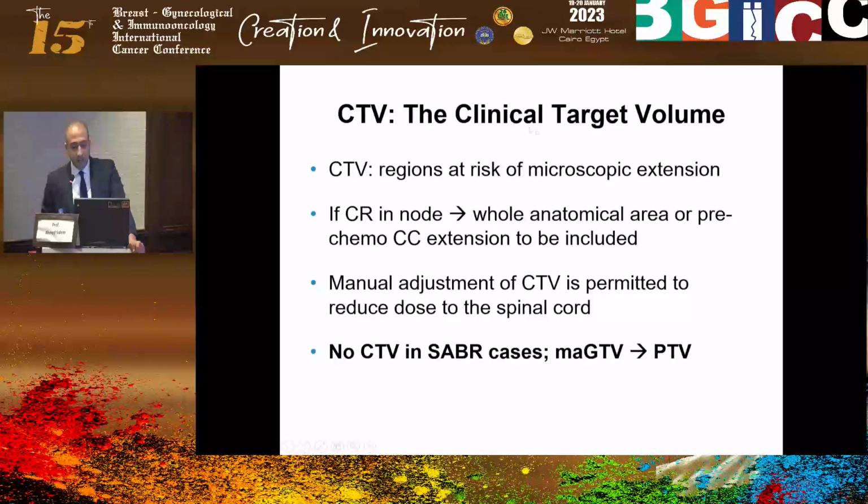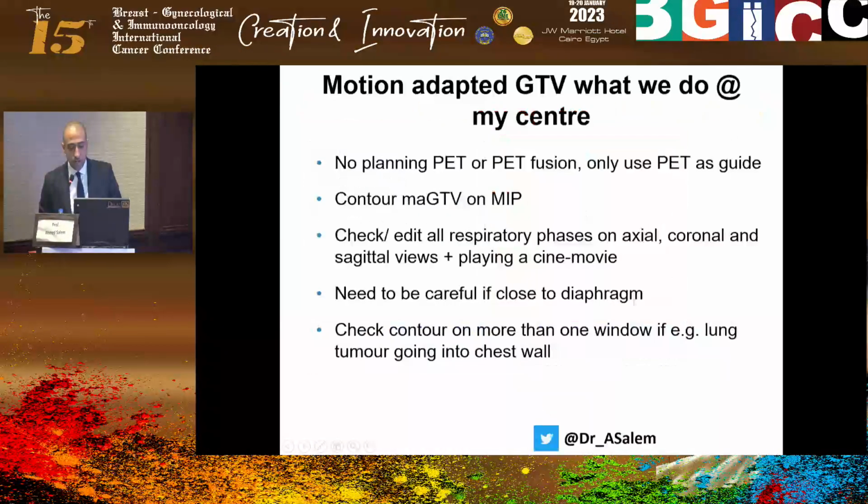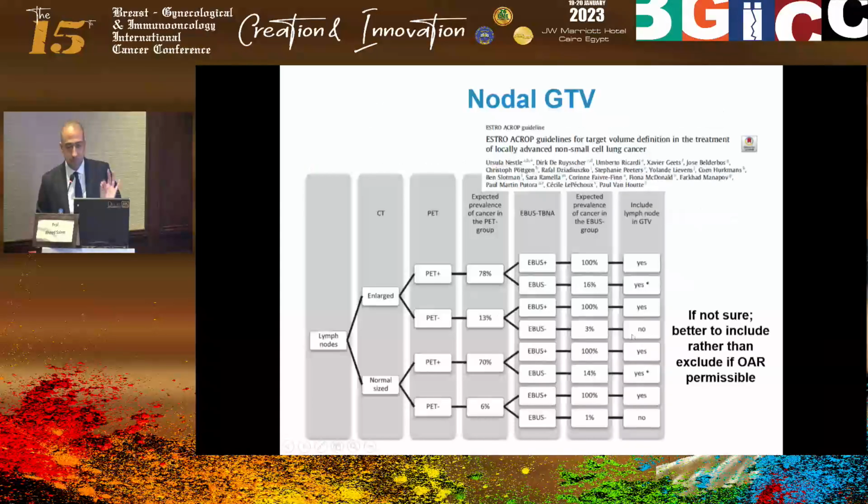Thank you very much, Dr. Ming. The only reason I would say sometimes it's okay to exclude a lymph node which is PET positive, EBUS negative, is that there is a reason why this lymph node is lighting up on PET. Sometimes the patient has sarcoidosis, for example, and this causes the lymph nodes to light up on PET. So there is a reason.